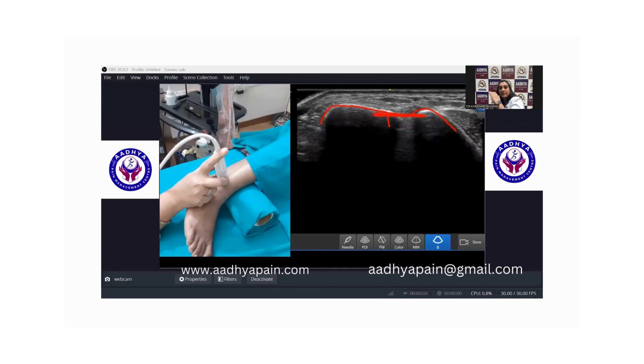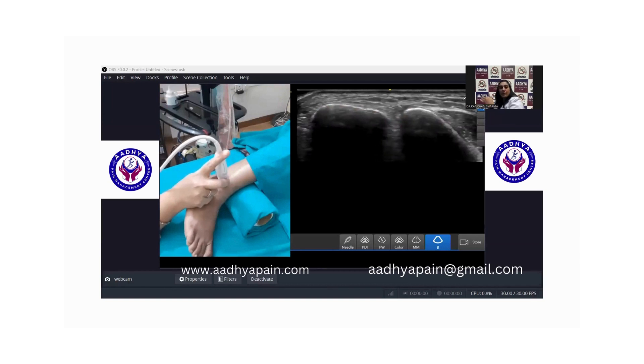At that point, try to draw a line — these two bones should be just equal to each other. Once you have confirmed that, maintain the same orientation and go down. You will see that the tibia goes off from our view and the talus comes into view.